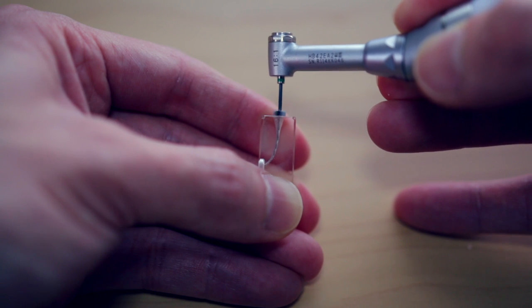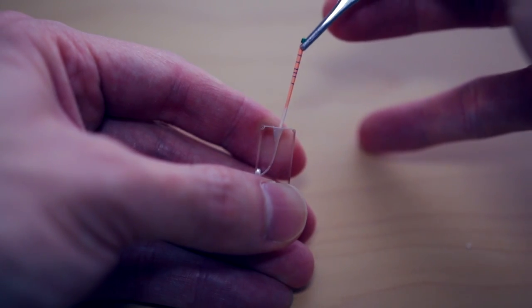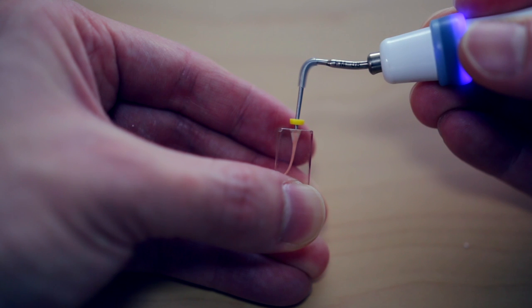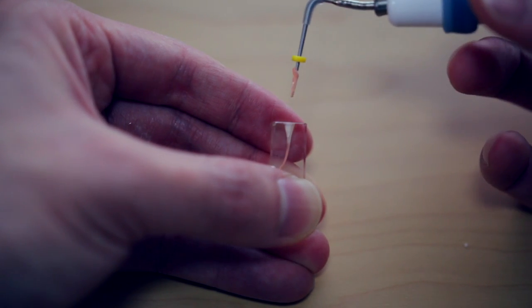I take a 35/04 master cone. After the first cone fit it was a little short, so I went back in quickly with the 35/04 EndoSequence file, and the second time it went to the apex. I then coat the master cone with the Meta Biomed sealer using pump motions down to the apex — this avoids the air lock that would prevent the gutta-percha from going all the way down while extruding the sealer against the walls. With the heat source at 300 Fahrenheit, I go down about five millimeters from the apex and sear off, let it cool for about 10 seconds, do a quick burst of heat again, then withdraw. It sticks to the tip and burns off cleanly. After searing off, I use a plugger right away to pack it down.